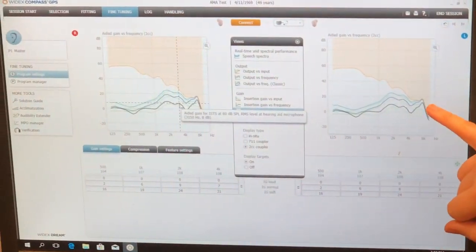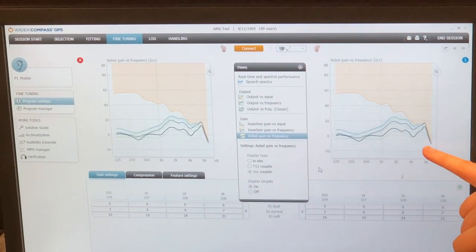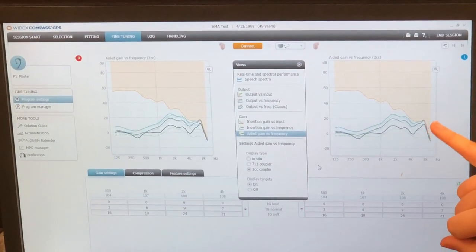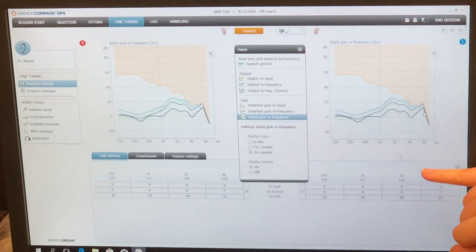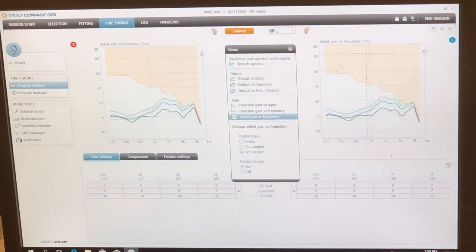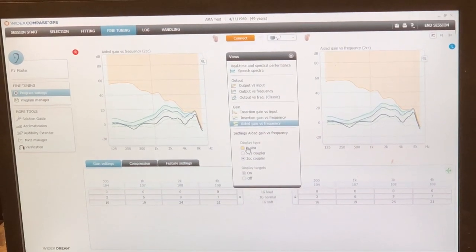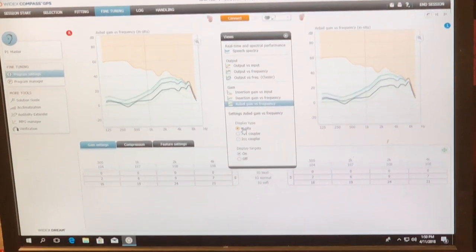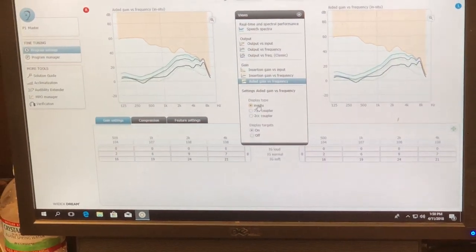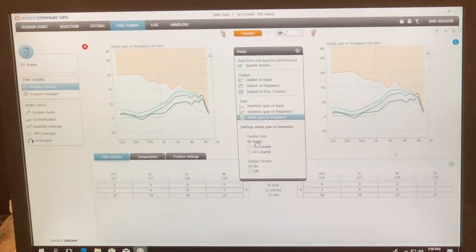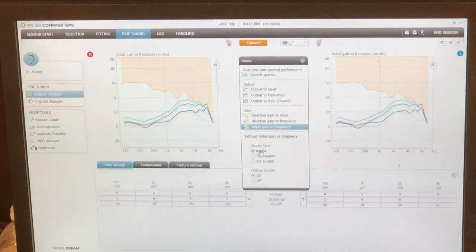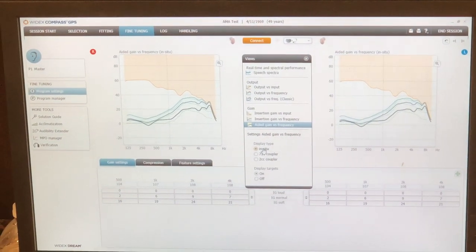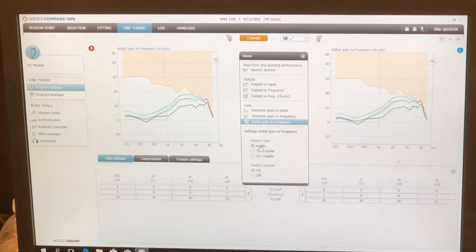Is this like saying that it's hitting the UCL at that frequency? UCL's way up here. And this is in a two CC coupler. If I do it in situ, it looks a lot better. What is the orange? Isn't that the limit of the device? Yep. That's the limit of the device.